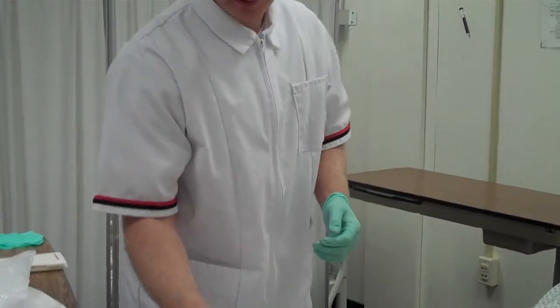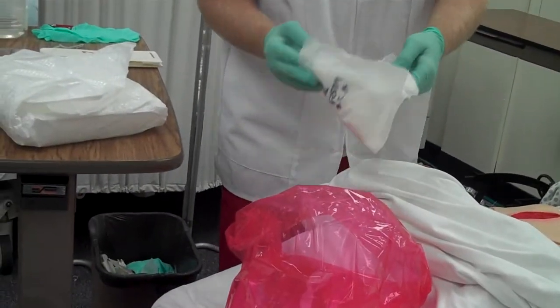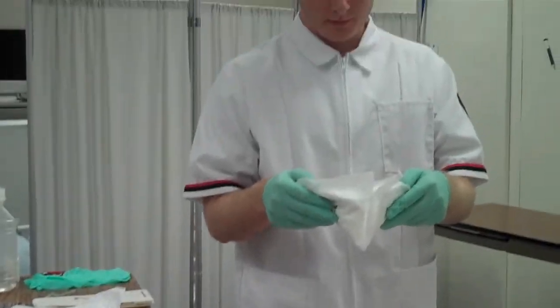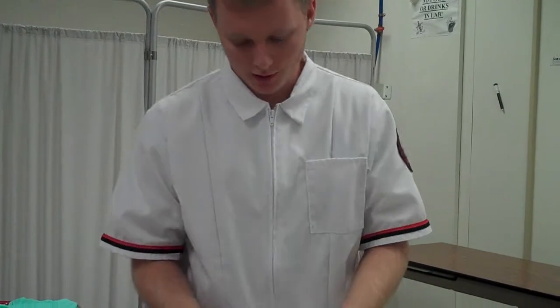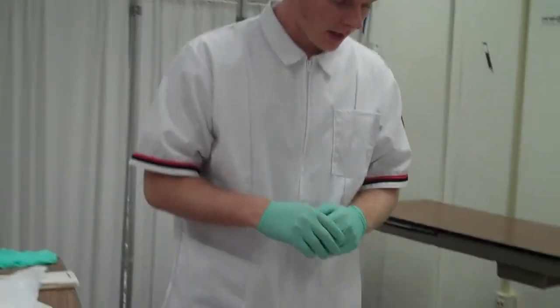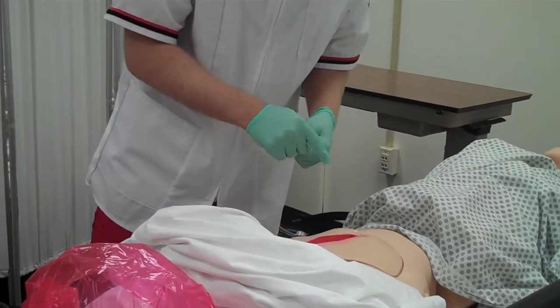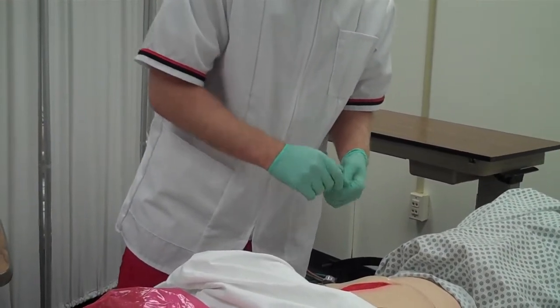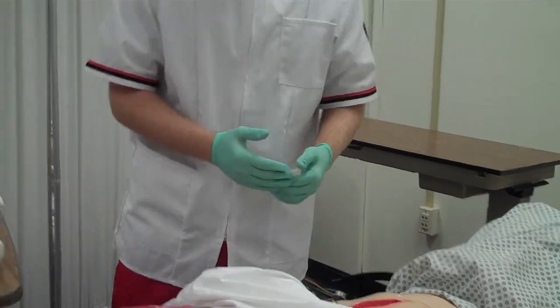Alright, I'm going to inspect the dressing, the drainage. I'm going to assess the color, the amount, and if there's any odor. And then next I would assess the wound itself. I'm going to assess the color of the wound bed, the wound edges, the wound closure, and if there's any drainage present.